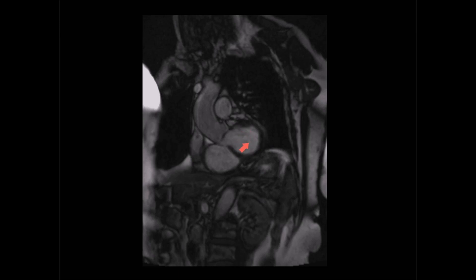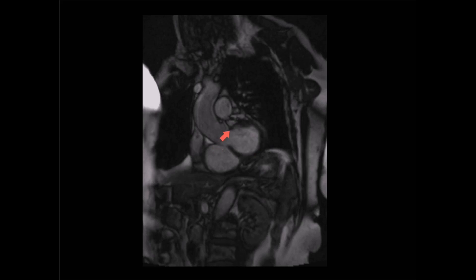Here's another view of the aortic valve known as the coronal left ventricular outflow tract, or coronal LVOT view. This is a view that's unique to CMR — it doesn't really have an echo equivalent. In this view we have the left ventricle, the aortic valve with thickened cusps, and the aortic root and ascending aorta. Using this view we can again measure the aortic root dimensions at the level of the aortic annulus, at the sinus of Valsalva, and at the sinotubular junction.